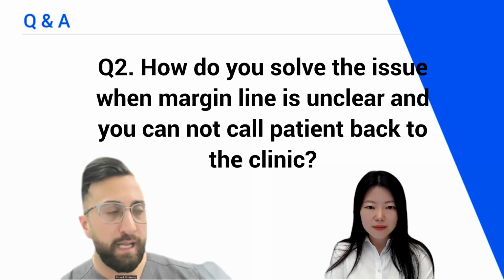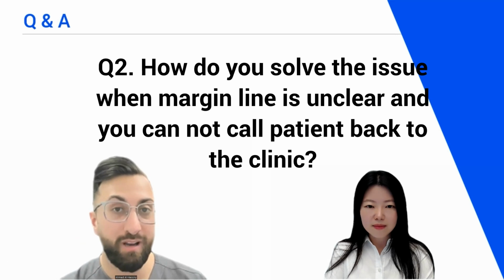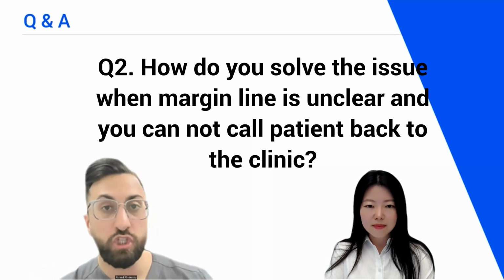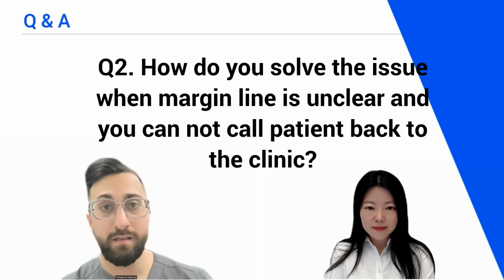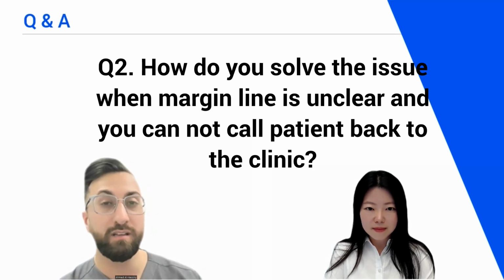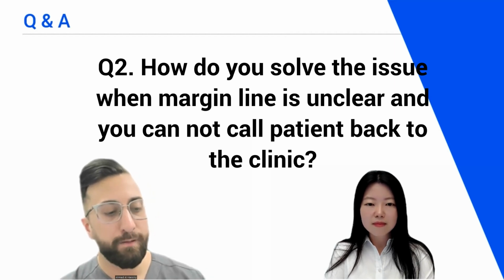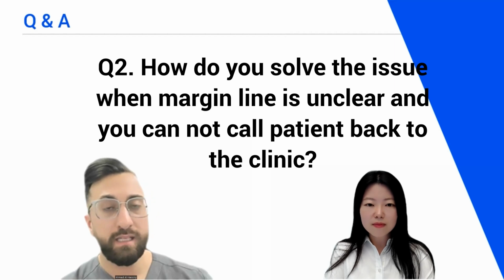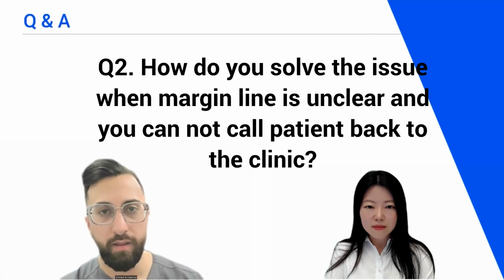And the reality is your lab will basically try to do the same thing. If they can't see the margin line, they will just edit the mesh to where they assume the margin line is. So hopefully you have some nice clinical photos of your prep, and then you can estimate where the margin line is. But the reality is, if it's a big error, it is hard to do post-op. If it is a small error, like a little bit of retraction cord, your lab should be able to handle that.